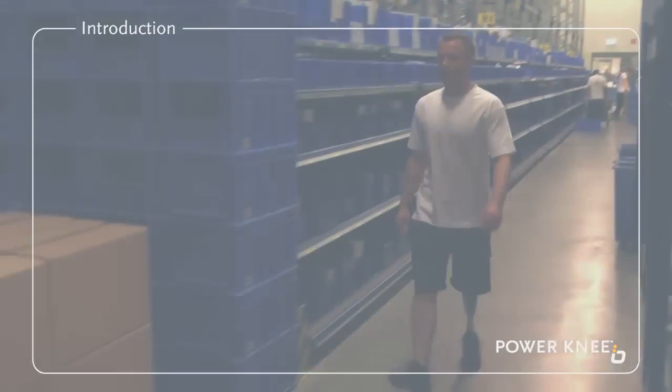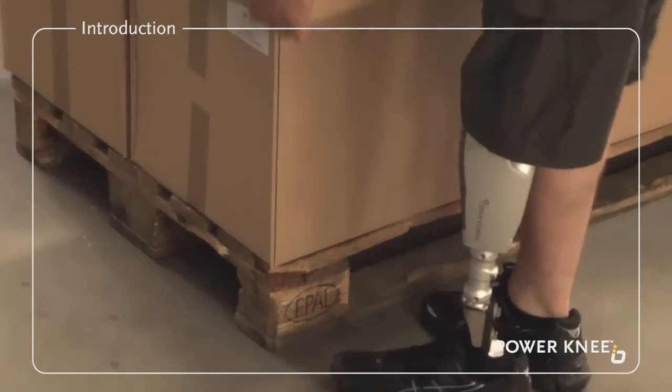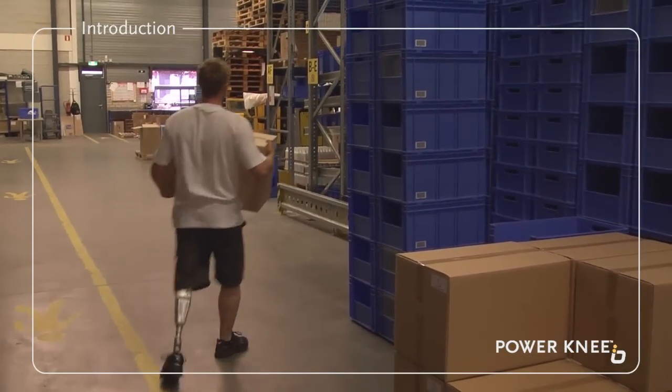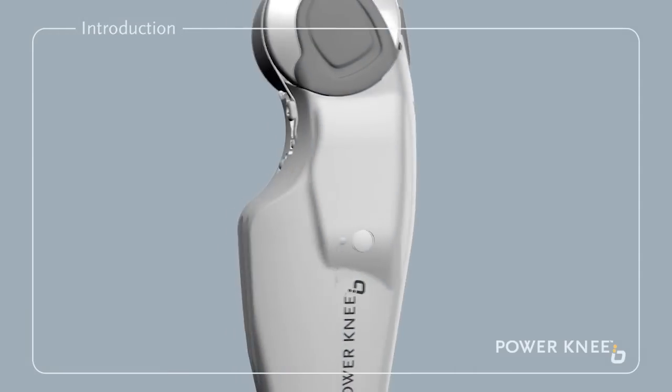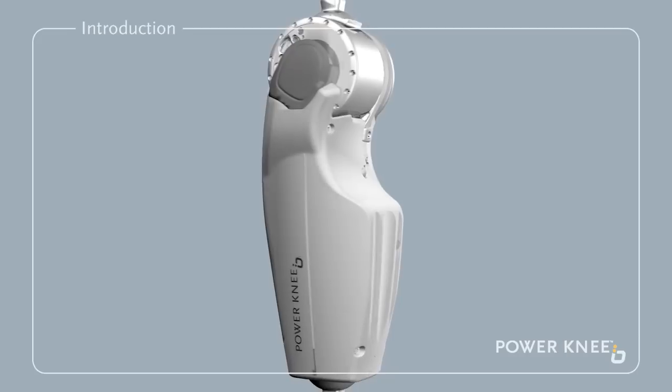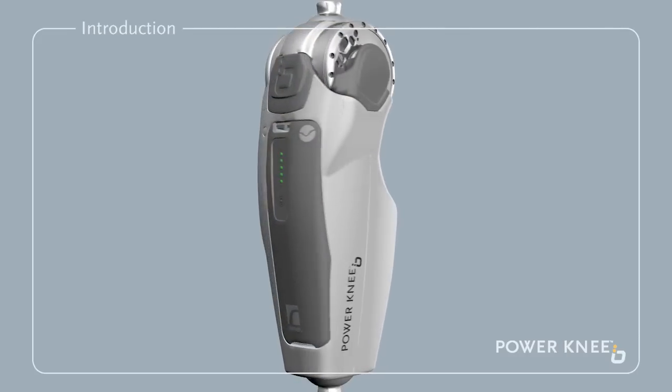For safety reasons, we ask you to follow the guidance given here and in the user manual in order to avoid malfunctioning of the knee and the potential risk of injury. And please make sure that you are able to recognize the audible and/or vibrating signal for power loss.